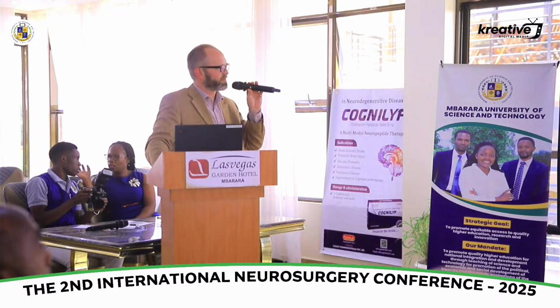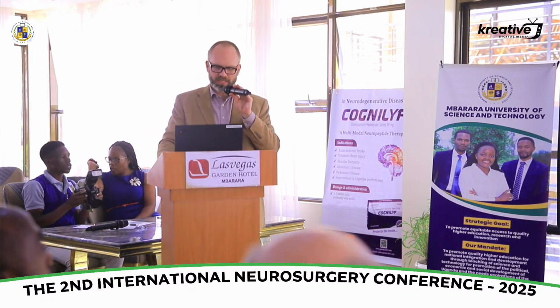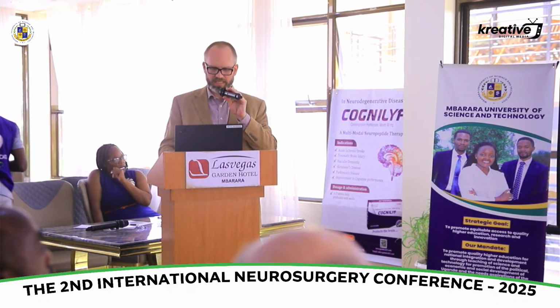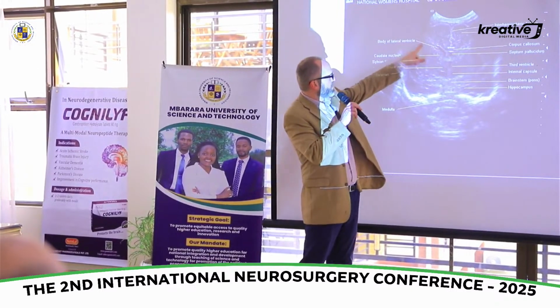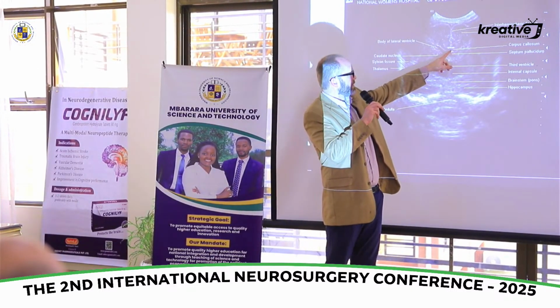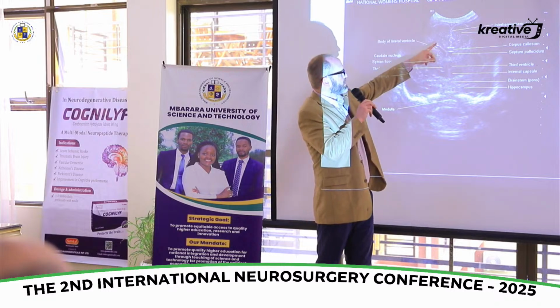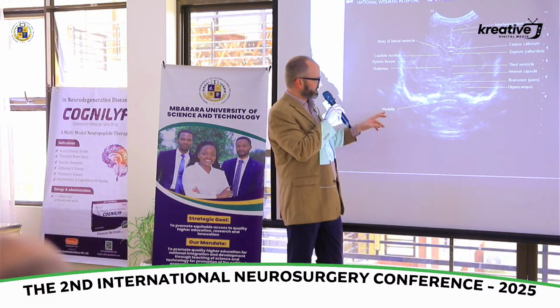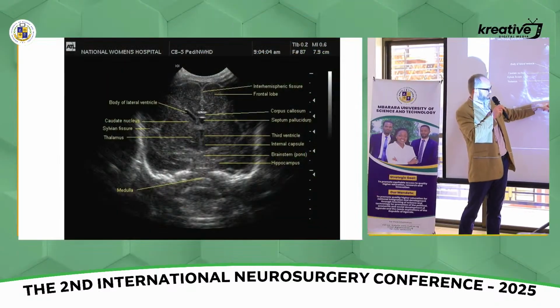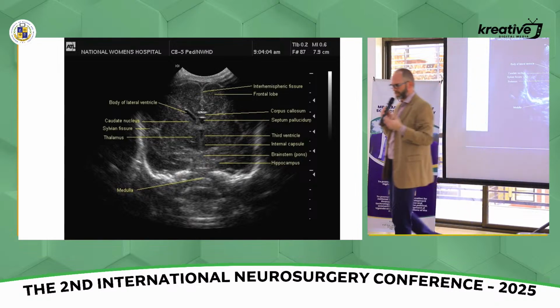But now we get back into the third ventricle. So you see these are all oblique views. They've been standardized in pediatrics, but they're not standard of CT or MRI. But you can see a lot of things, and that's where this is valuable, right? So CSF, the body of the lateral ventricle, is going to be quite dark. The basal ganglia are going to be brighter because they're gray matter, and meninges are going to be quite bright. So you have interhemispheric fissure, and then if you get back, so this is medulla here, and what you're seeing there is the choroid plexus going out, foramen of Luschka, which is why it's bright. Otherwise, the brainstem is quite dark because it has such a concentration of white matter.